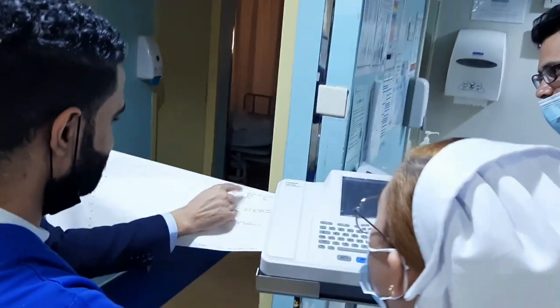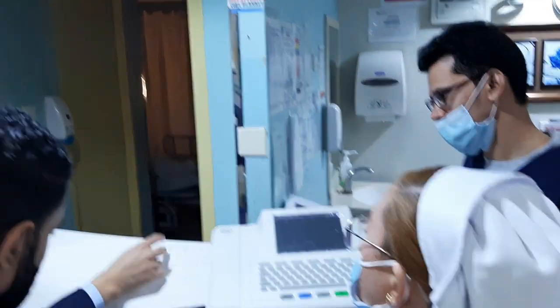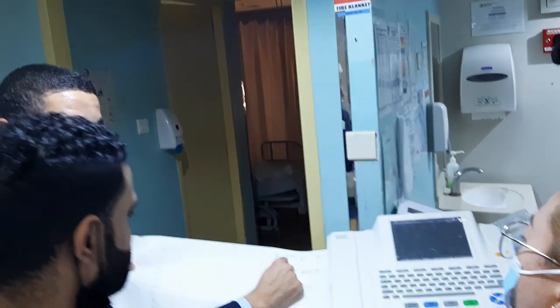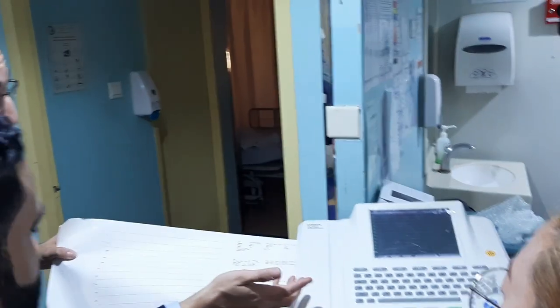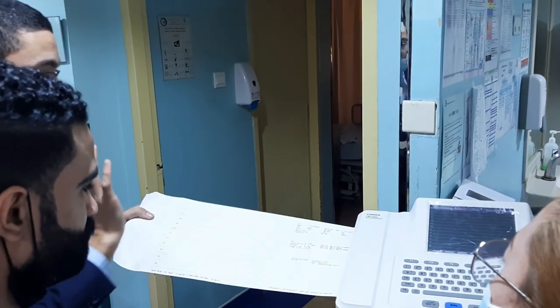So beginning from patient number 0 until you finish your patient. The ID is automatic. The name, gender, age, hospital number, and file numbers, you enter already. There is also an automatic diagnosis, but this is the primary diagnosis, the most important doctor diagnosis, just primary.